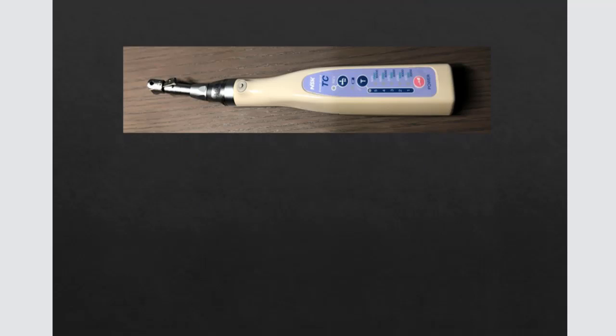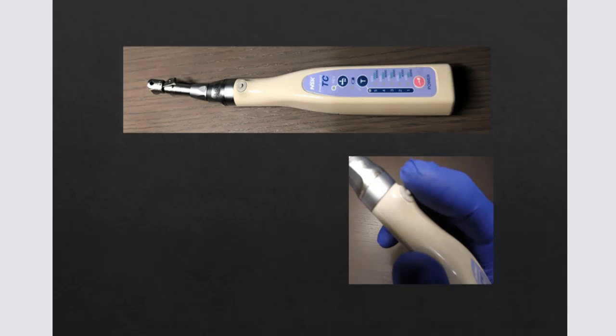So my first venture using cordless handpieces was an early generation NSK handpiece called the Endo Mate torque control handpiece. And this handpiece worked well for many years for me. It had a simple on-off button. It had variable speed settings. I think the speed settings went from 100 RPMs up to 625 RPMs, or from like 150 RPMs to 1,000 RPMs, depending on the reduction angle that was used on the handpiece.